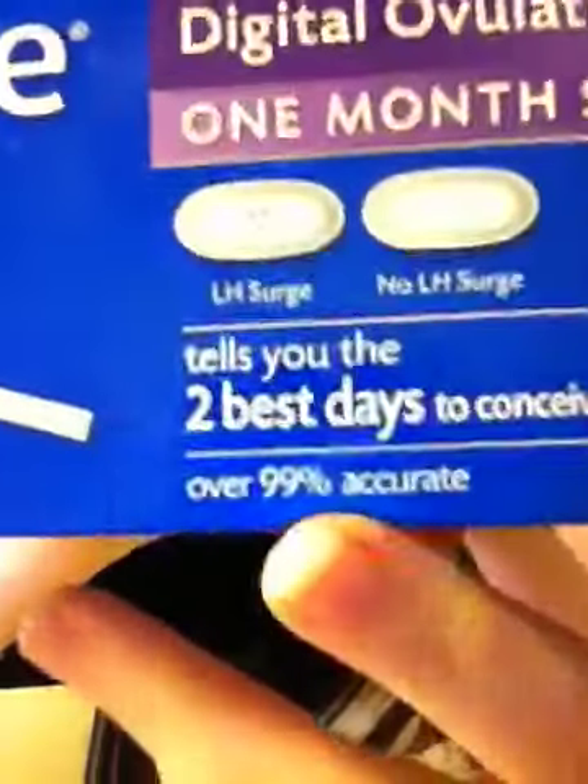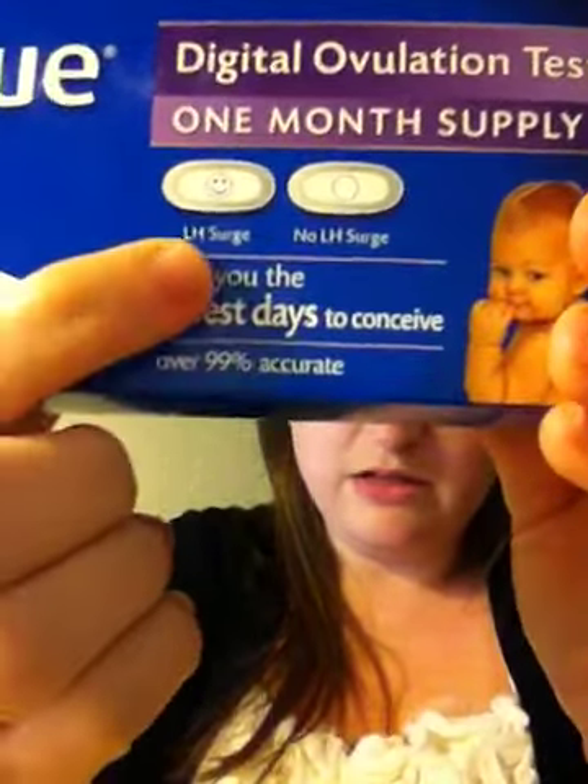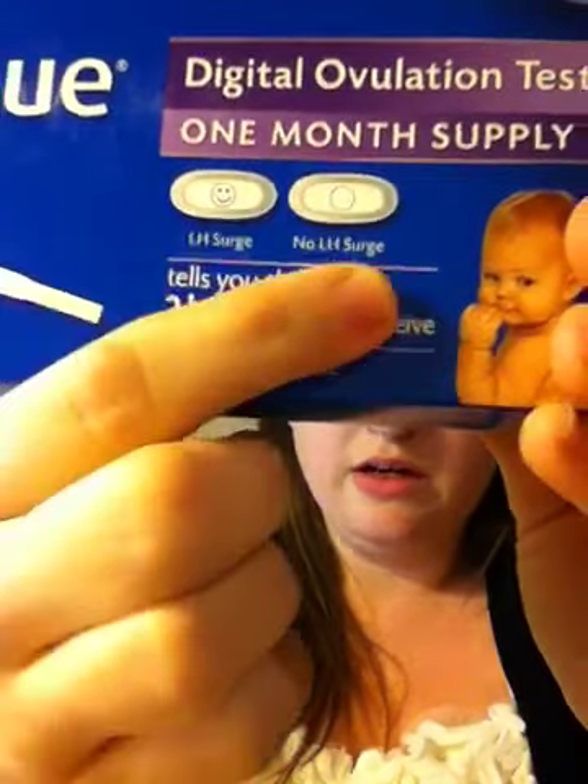When you OPK — pee on the stick — you'll wait three minutes, and it does take three minutes. When three minutes is up, you'll see one of these: it's either an empty circle or a smiley face. The circle shows as complete, but there's actually a little tiny spot at the very bottom of the face — just a little dot that doesn't connect. So you'll either get smiley face or no smiley face. Smiley face means you have an LH surge, which means you're about to ovulate. Then you have 24 to 36 hours after your last OPK until you ovulate.